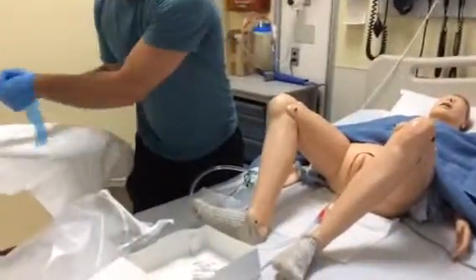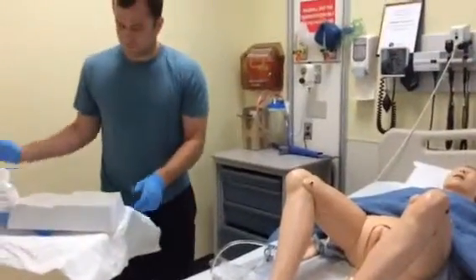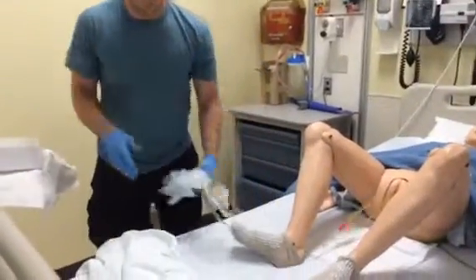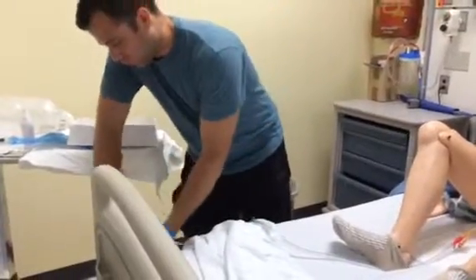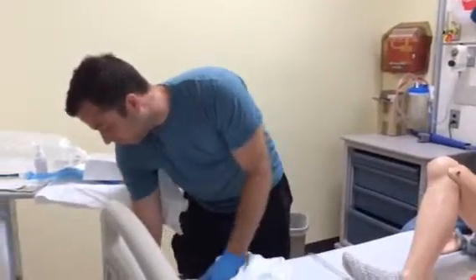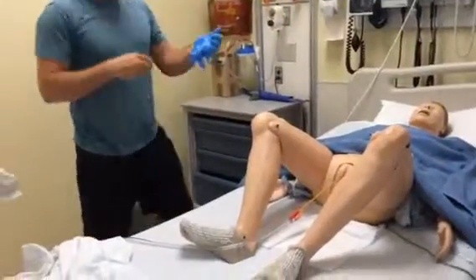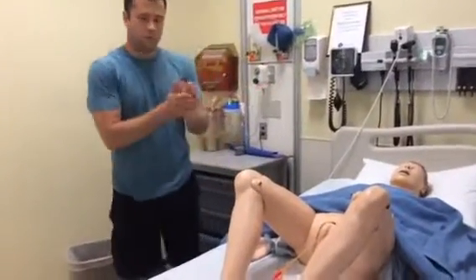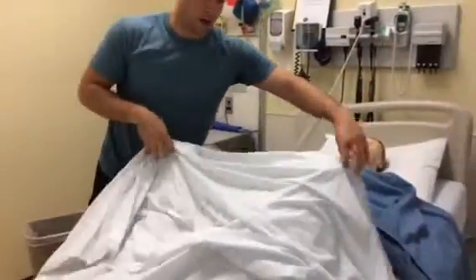I'd remove all of these supplies. And I would attach this down here. Let's see. Okay. Let me take off these gloves. Hand hygiene. And we'll get the patient set back up.